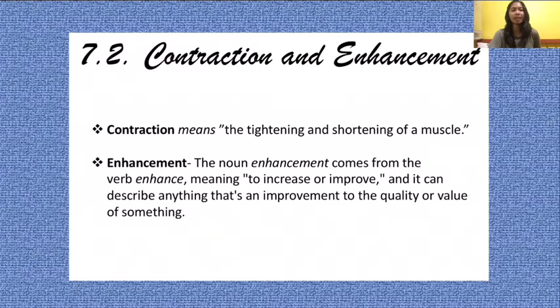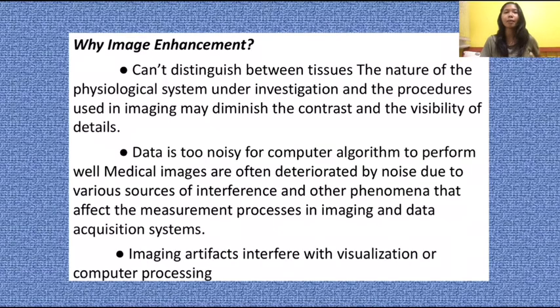The image should be enhanced. Why image enhancement? We can't distinguish between tissues, the nature of the physiological system under investigation, and the procedure used in imaging may diminish the contrast and visibility of details. Data is too noisy for computer algorithms to perform well. Medical images are often deteriorated by noise due to various sources of interference and other phenomena that affect the measurement processes in imaging and data acquisition systems. Imaging artifacts interfere with visualization or computer processing.